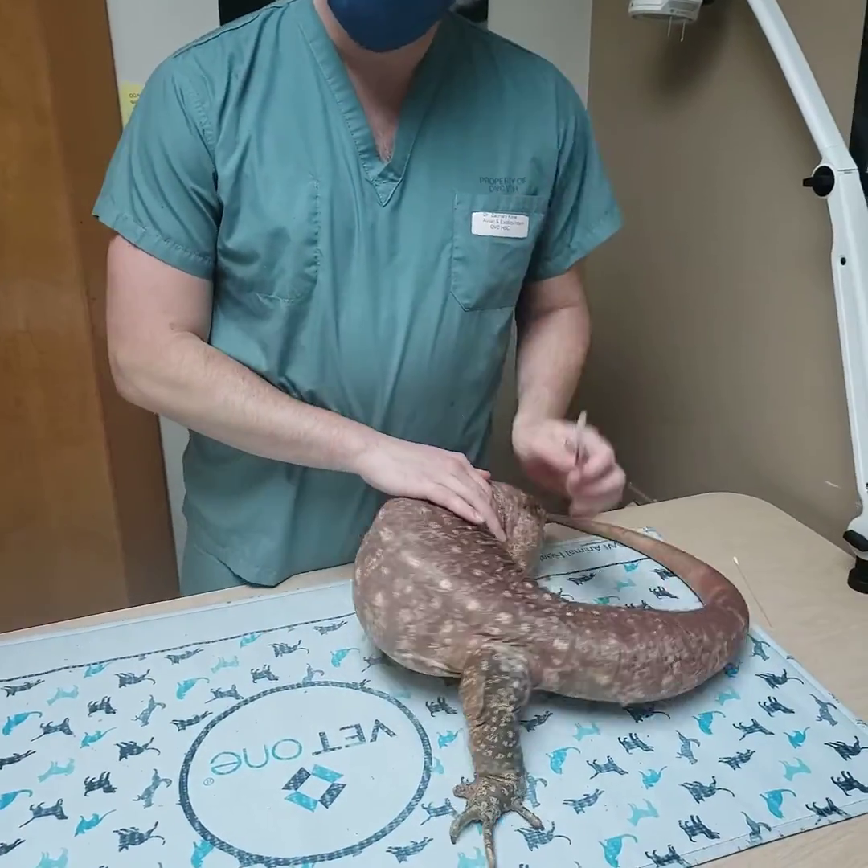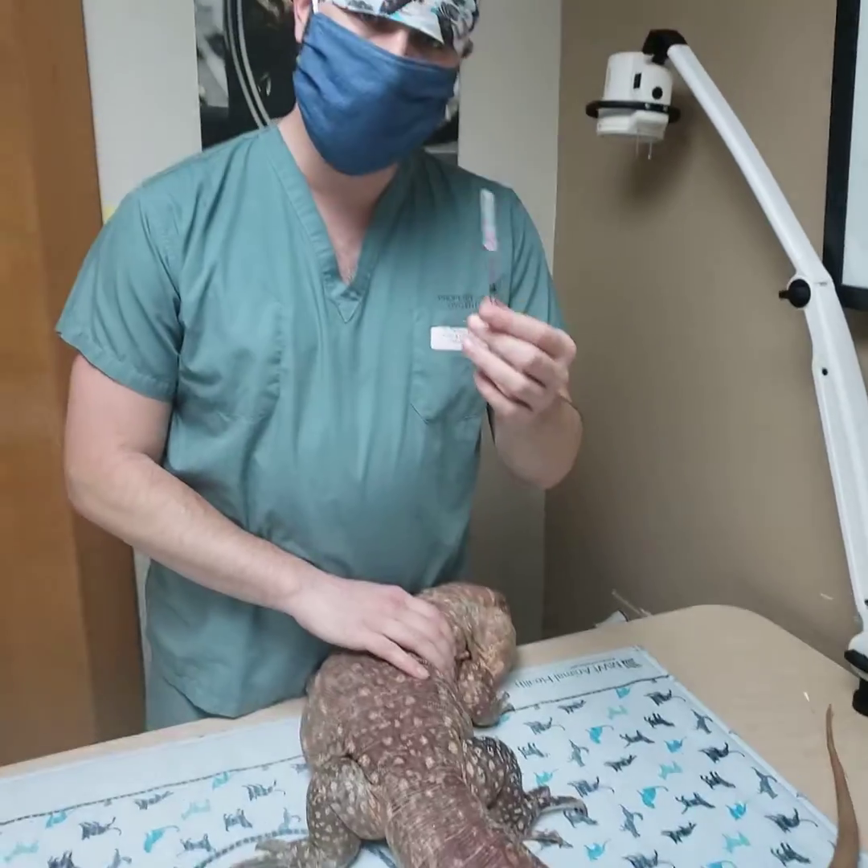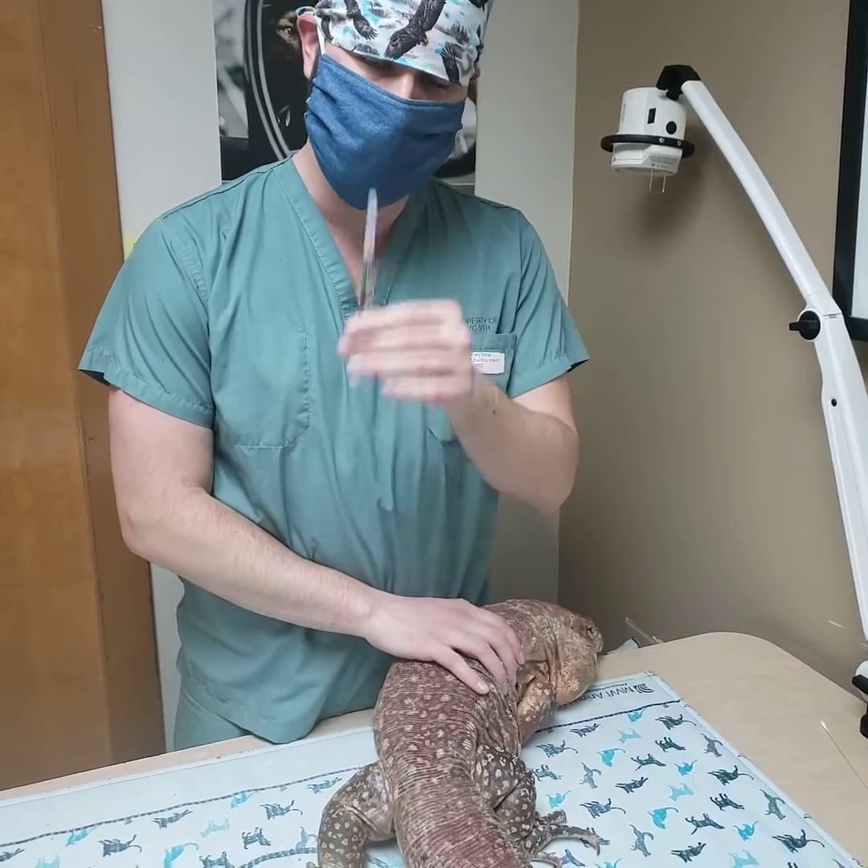This is Dr. Klein with Smaug here. We're going to demonstrate how to give a subcutaneous or intramuscular injection of Fortas, which is an antibiotic.